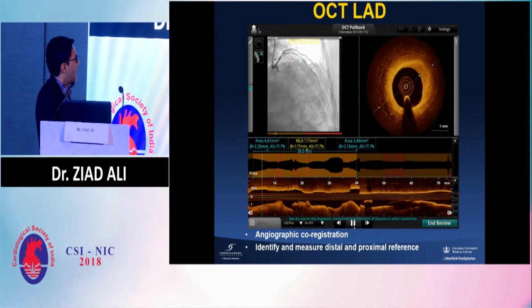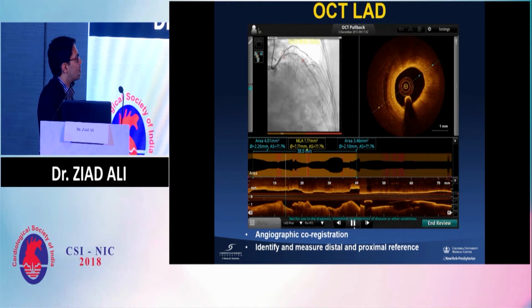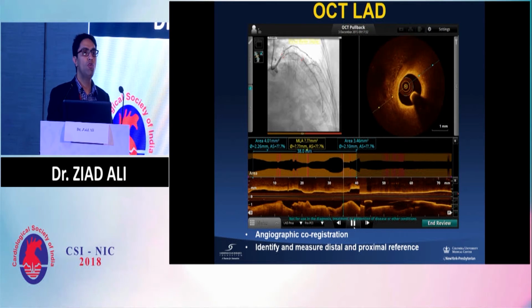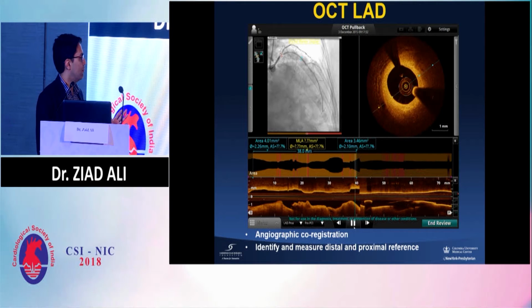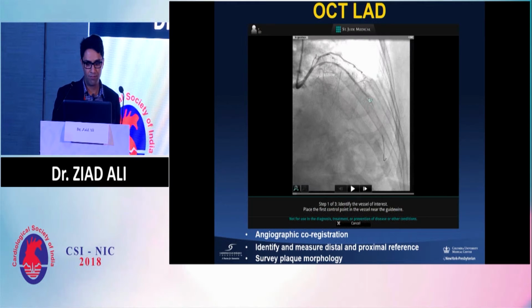Now we peruse through the plaque morphology, and the question comes: is there anything in this lesion that's going to preclude the expansion of the stent? There's the plaque rupture, there's the cause of the ACS, but critically there's no calcification. So already you know there is no need to spend money on a pre-dilation balloon. Just go now with the next stent move, which is the direct stenting.